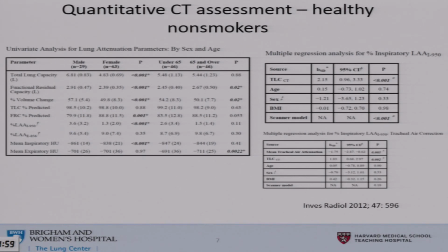So in this cohort of healthy non-smokers, this was first used to establish quantitative CT scoring.